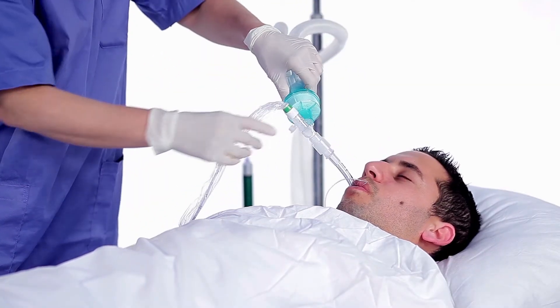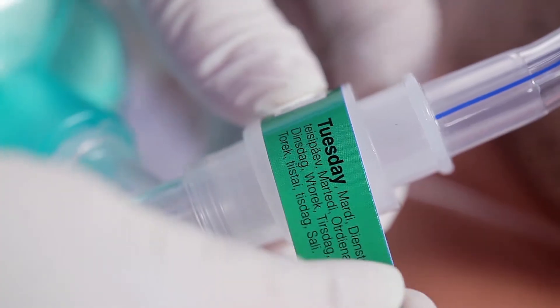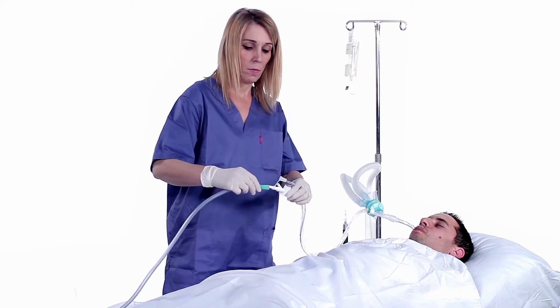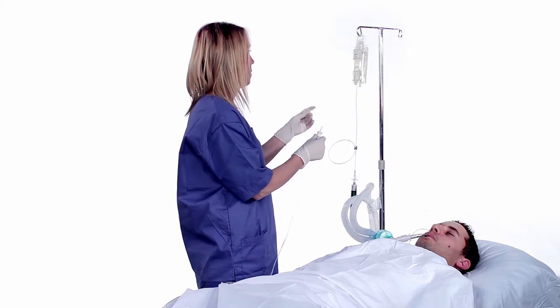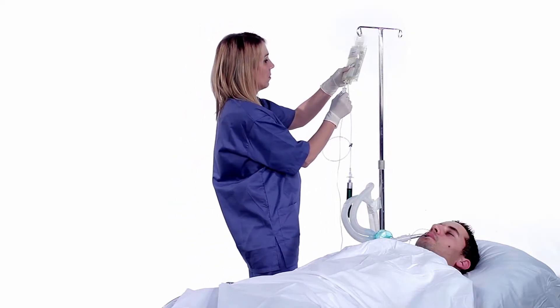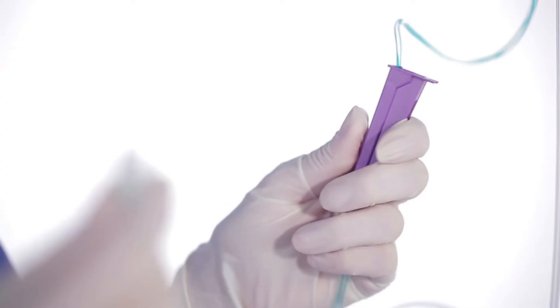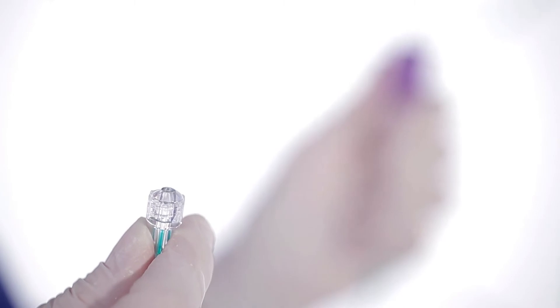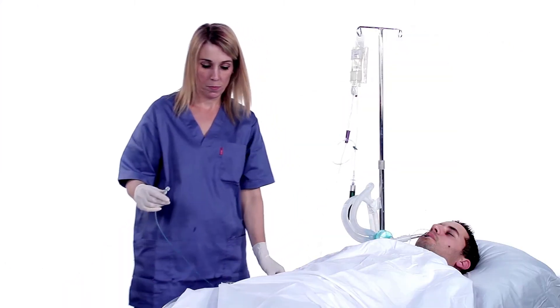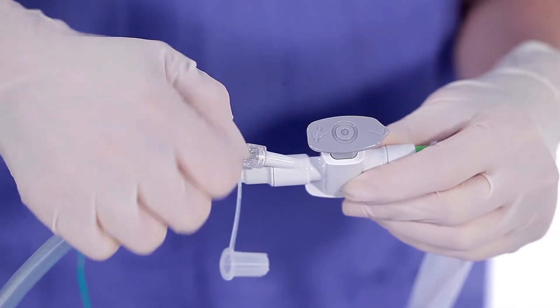Connect the Airway Medics between the endotracheal tube and ventilator circuit. Attach the date sticker and connect the vacuum source. Connect the supplied extension line via the spike to the saline bag in the pressure bag.